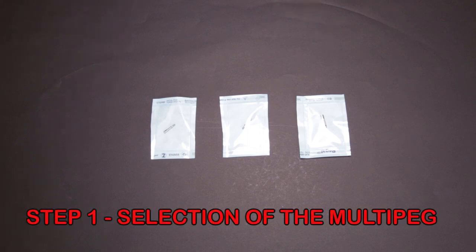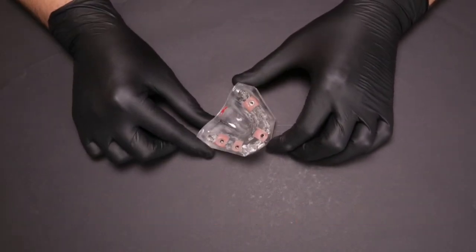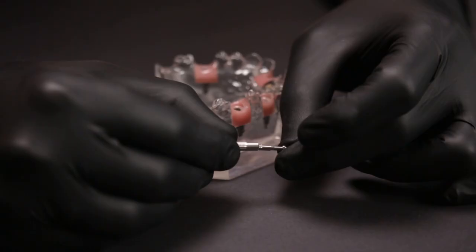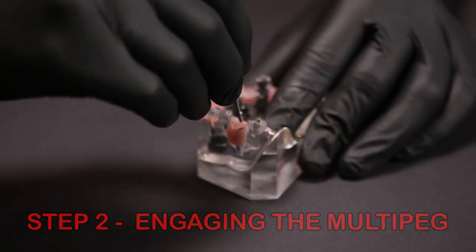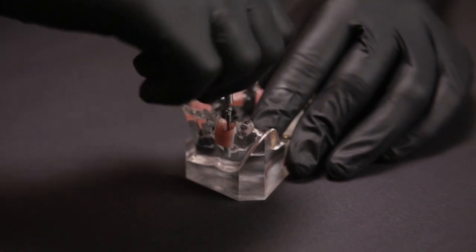The first step is to select the right multi peg for your implant system. Here I have a model with Nobel Biocare implants with a conical connection, so I take the corresponding multi peg and keep it ready with the multi peg driver. The next step is to remove the healing abutment and engage the multi peg into the implant using the special driver.